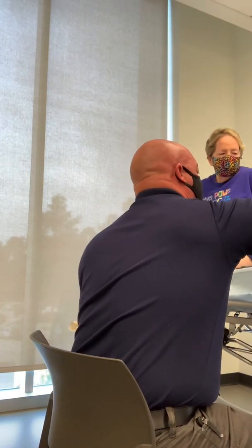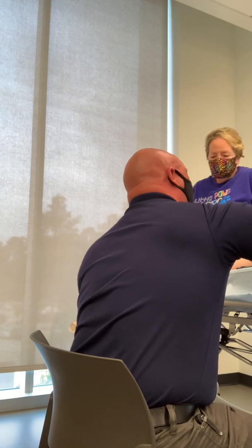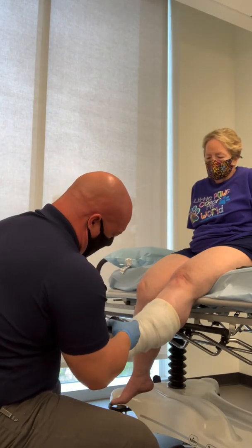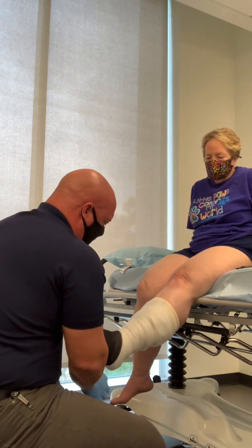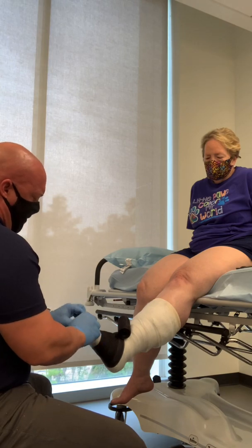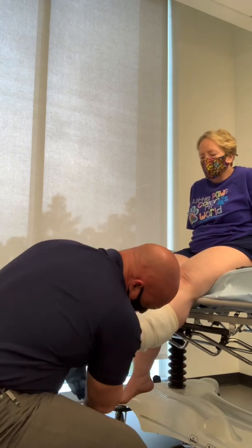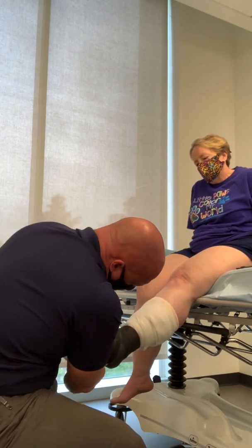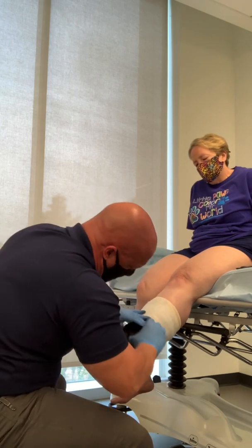One simple dunk and squeeze. Having a drape on the floor is appropriate if you think you're going to drip a lot of excess material. But if you get it nice and squeezed out, you should be okay to begin the wrap procedure. I always start with the foot. I tend to put a layer down on the foot first, doing a nice double layer on the foot — addressing the foot, ankle, and heel first before I worry about the rest of the leg.